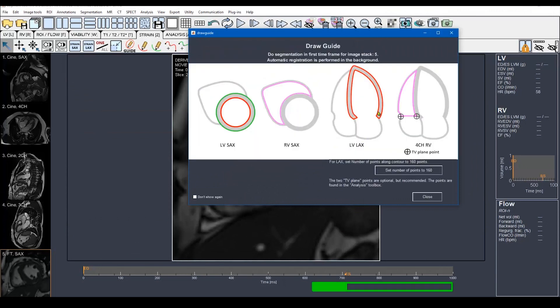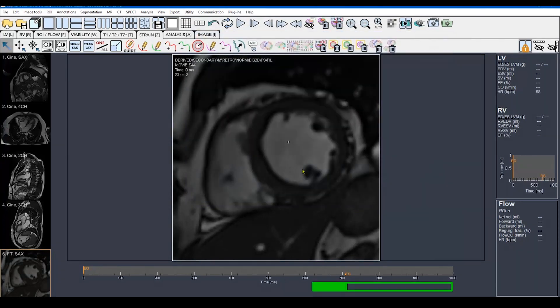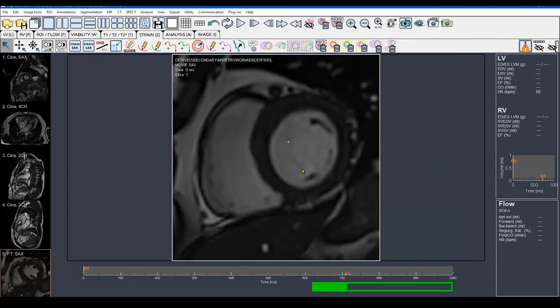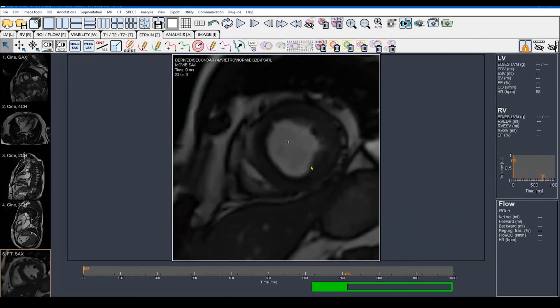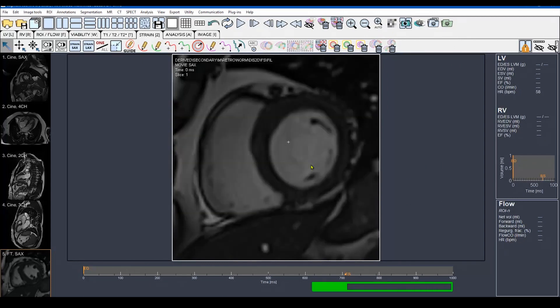This is the drawing guide, which I'm going to ignore. These are the three selected slices: the basal slice, the mid slice, and the apical slice we have already selected. Now we are ready to start drawing the endocontours and epicontours. For the LV endocontour, we use the red line. I will select this and start drawing the endocontours.